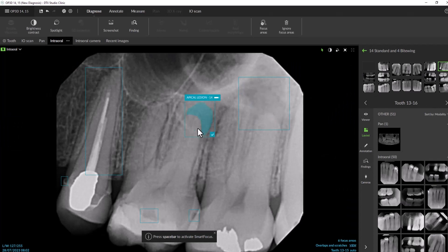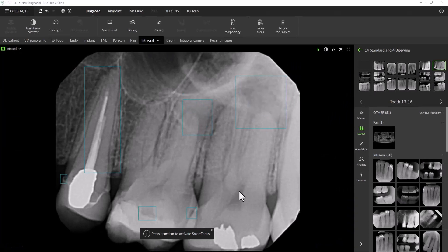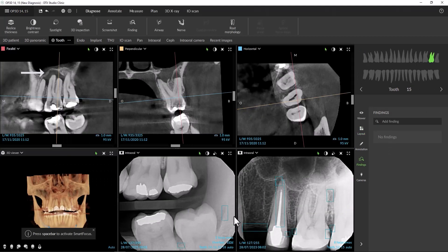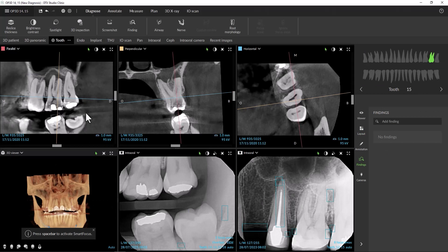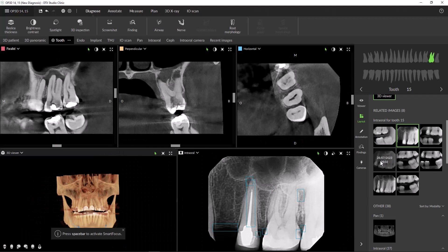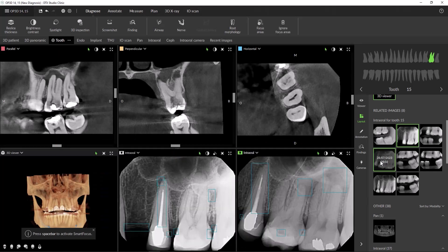Let's look further into these two radiolucencies found on this PA. Using Smart Focus, we'll select tooth number 15. We can clearly see that our 2D findings were accurate when it found those two radiolucencies. Notice the sagittal and coronal views clearly showing this large lesion.